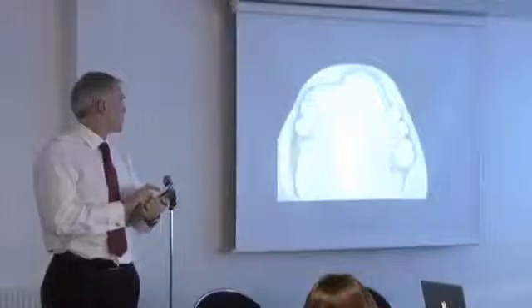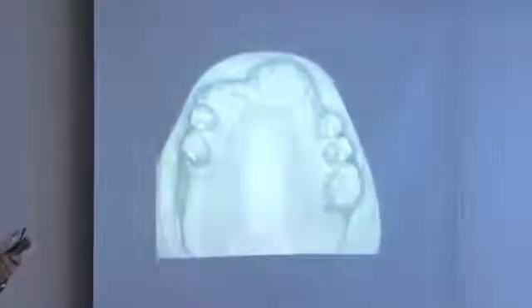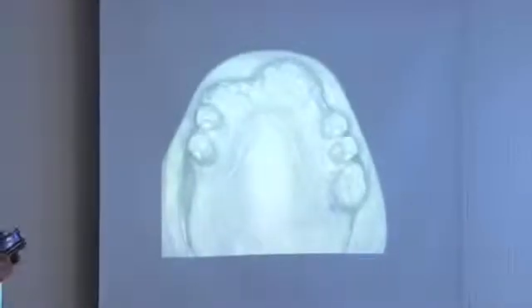So what I'm going to do is design a denture slightly different from the way we normally do it. A lot of people here will design their dentures. Some people won't design them. Some will send them off like an acrylic. You might take a better impression, it might be a silicone, but you'll send it off and you'll say, chrome denture, please, and let the technician design it. I know that because I talk to technicians and that's what they tell us happens. In this situation, you do have to design it.